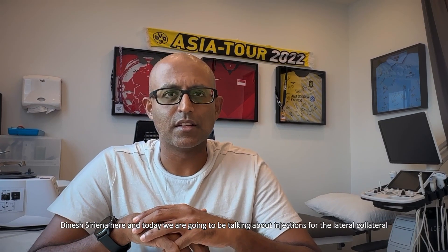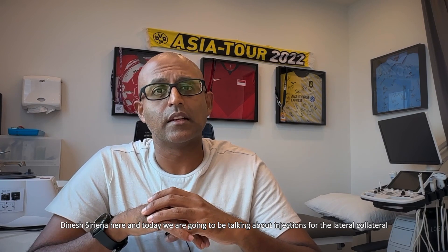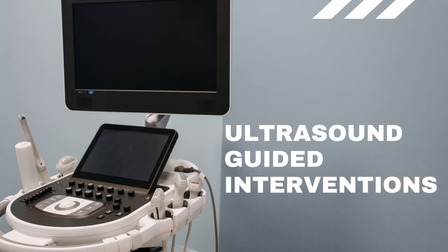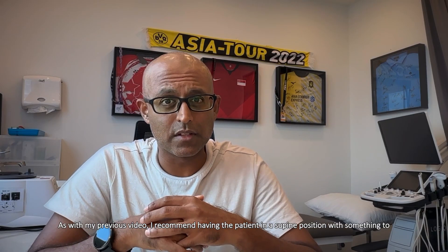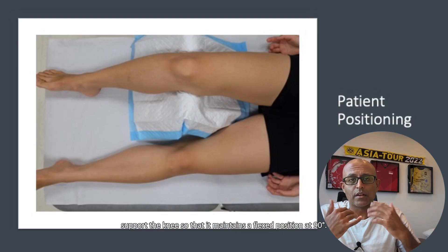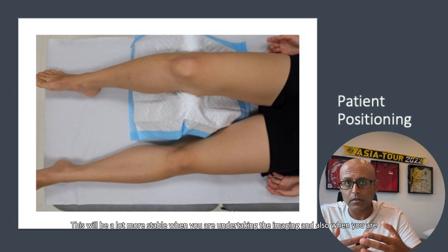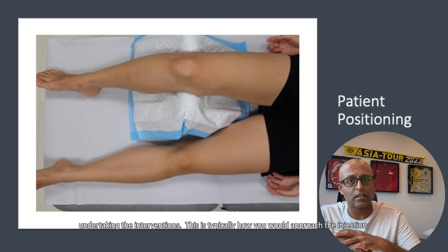Hi everyone, Dinesh Siracena here, and today we're going to be talking about injections for the lateral collateral ligament. As with my previous video, I recommend having the patient in a supine position with something to support the knee so that it maintains a flexed position at 90 degrees. This will be a lot more stable for when you're undertaking the imaging and also when you're undertaking the interventions.